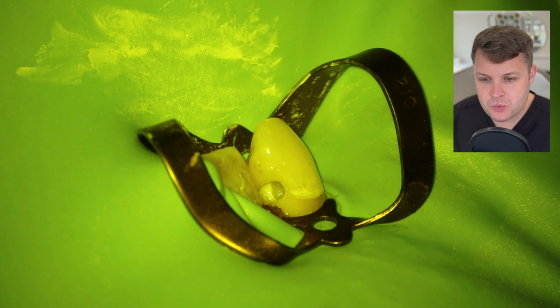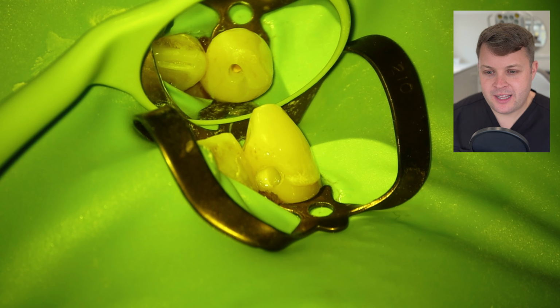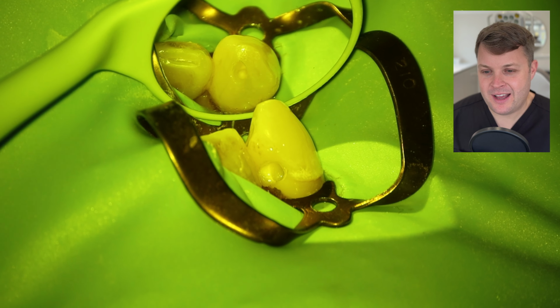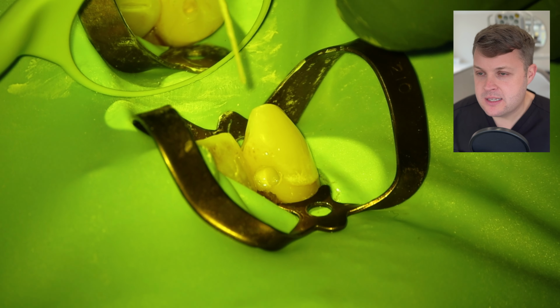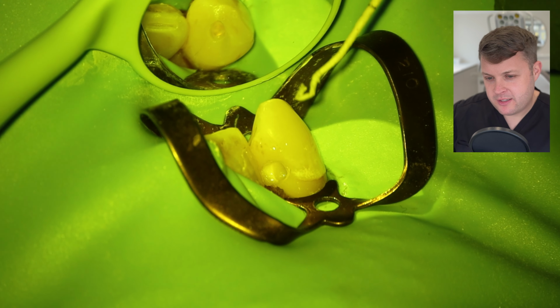And then we're going to use our self-etching bond. We're going to light cure it both ways, and then you can see here now that the GP is all nicely condensed down. We're then going to use our SDR. This is smart dentin replacement. It's a bulk flow composite, and it's going to fill everything nicely up.